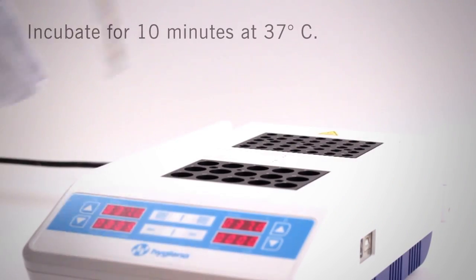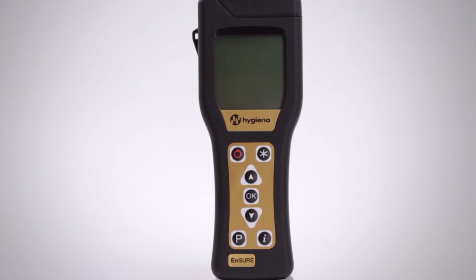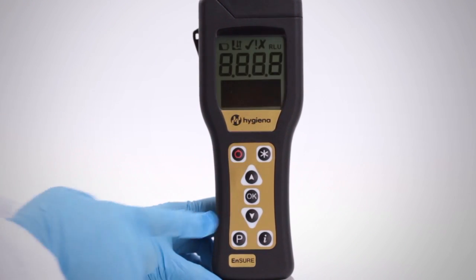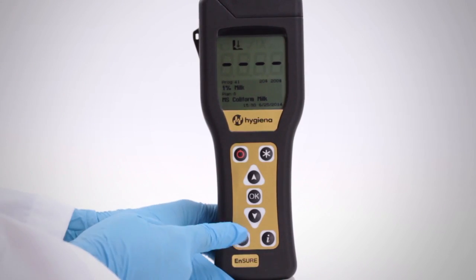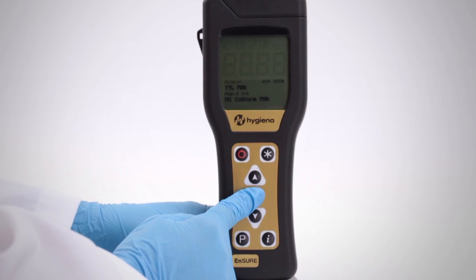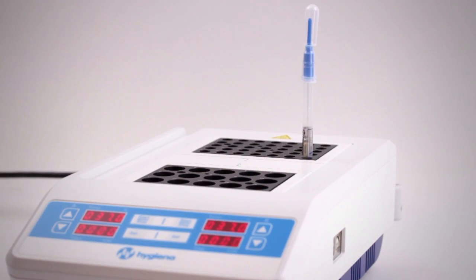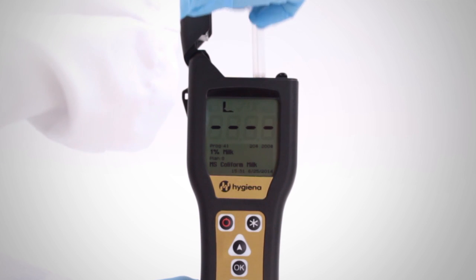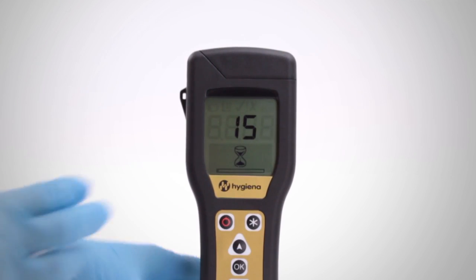Incubate Microsnap Coliform for 10 minutes at 37 degrees Celsius. Meanwhile, turn on the Ensure Luminometer. If you have programmed locations, navigate to the appropriate location for this test. After 10 minutes of incubation, immediately insert the Microsnap detection device into the read chamber. Close the lid and press OK to initiate measurement. Results will be displayed in 15 seconds.